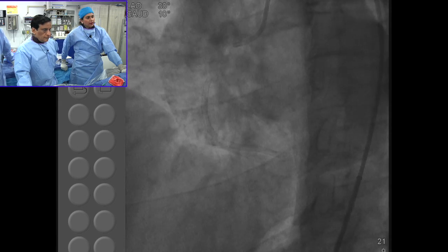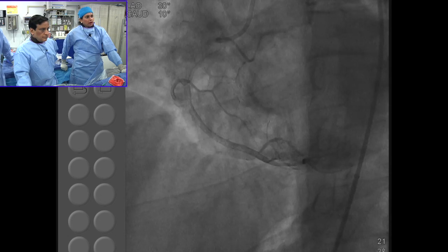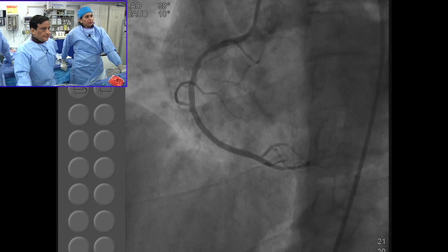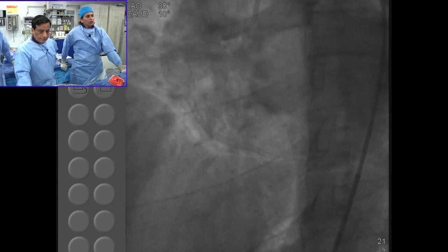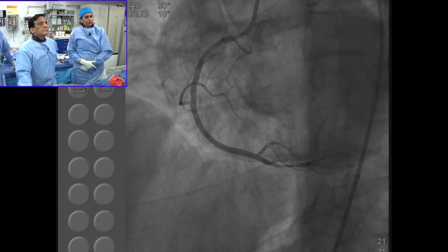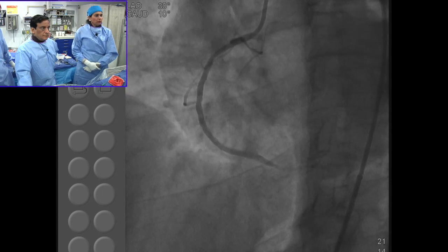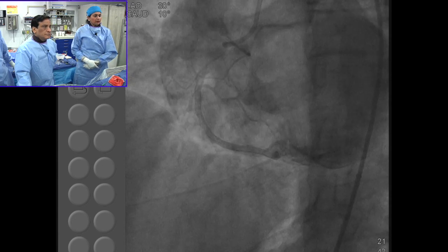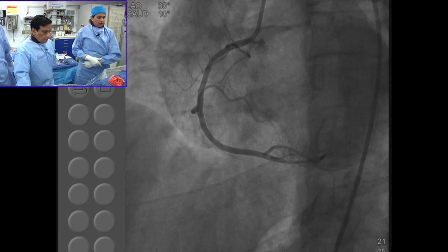If the transit catheter has not crossed the CTO, then you go with the smaller balloon. You have a 1.2 balloon that comes in 6 millimeter, 8 millimeter, 12 millimeter, or you have 1.5 which comes in 9 or 12 millimeter. So if the transit catheter does not cross, you can take the 1.2 balloon with the shortest length, whatever is available, and just escalate henceforth. But this is a key decision, what should be the balloon size.